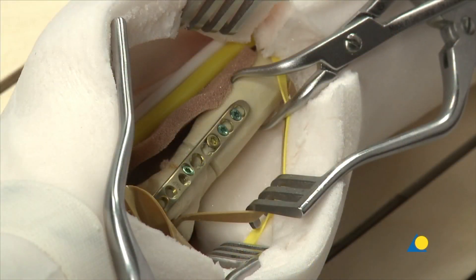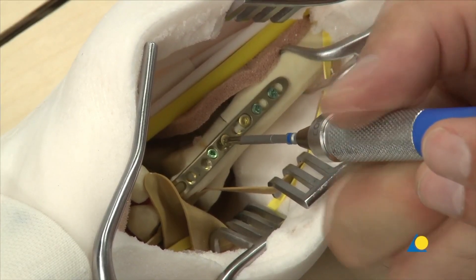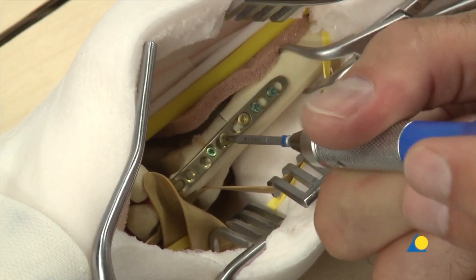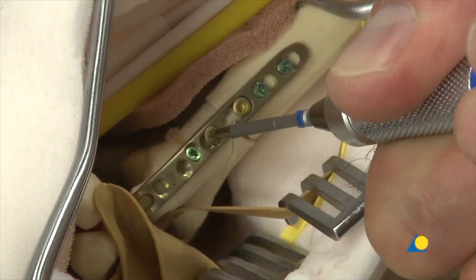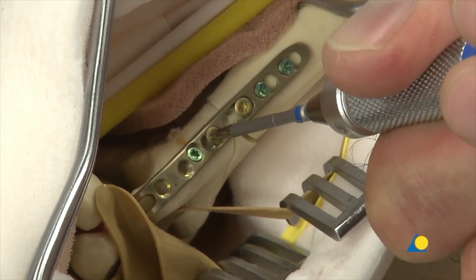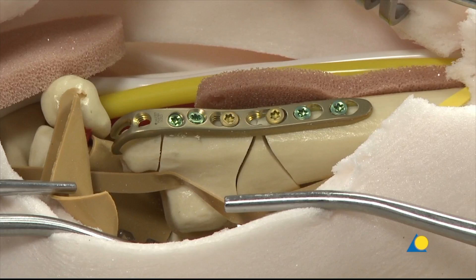Two locking head screws are inserted through the most proximal plate holes. A 2mm cortex screw is inserted on the other side of the fracture line and fully tightened to bring the bone to the plate. A 2mm locking screw is inserted in the second most distal plate hole to increase stability of the ulnar head fragment.